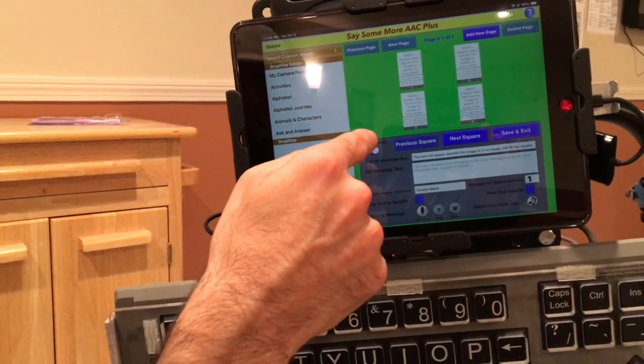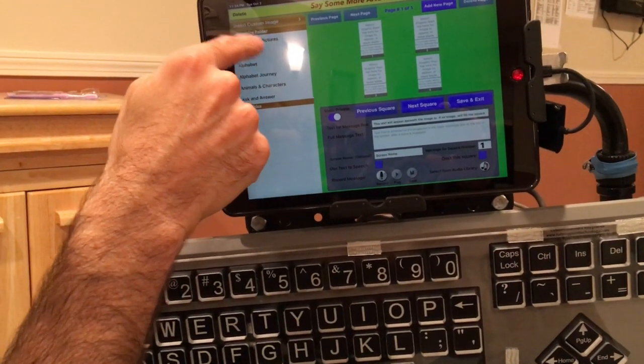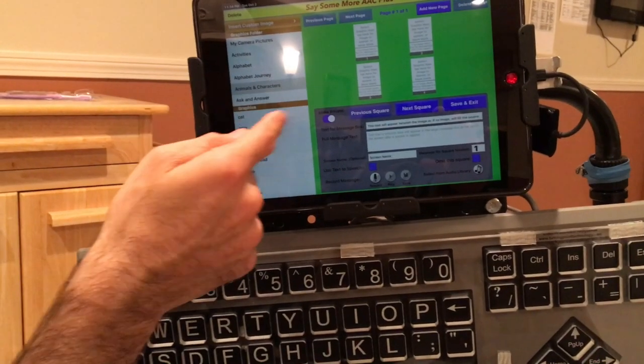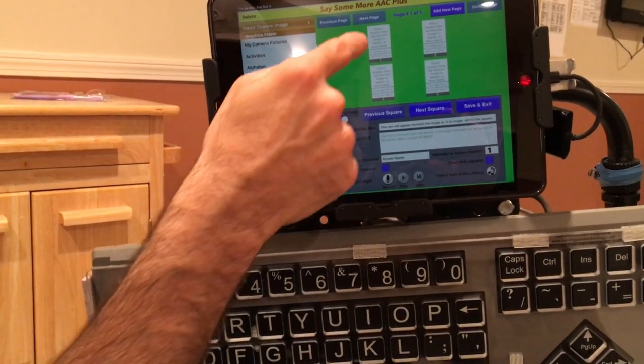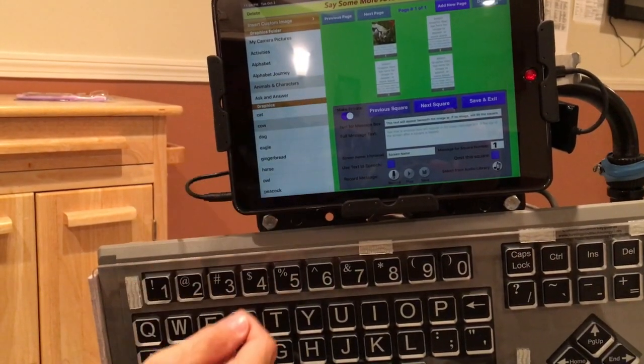You're going to use the same procedure as before. We want to insert an image. We can do something we already know is in the library here. Let's just find one in the existing library. Okay, there's a cow. It's a cow picture. We know cow is selected. Now we click on which square we want it to go in, and there's the cow.